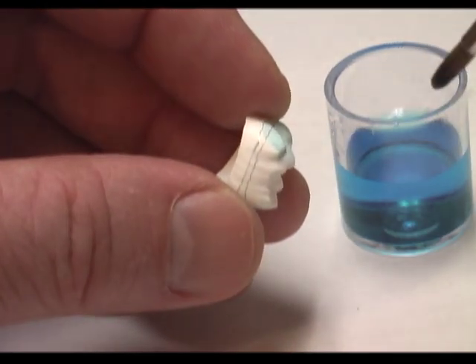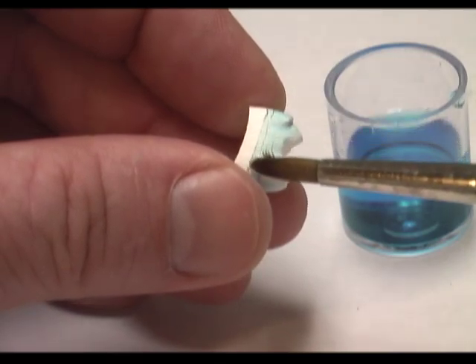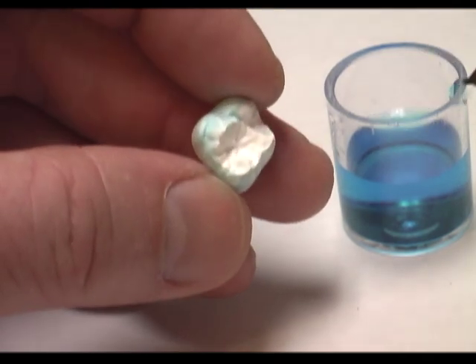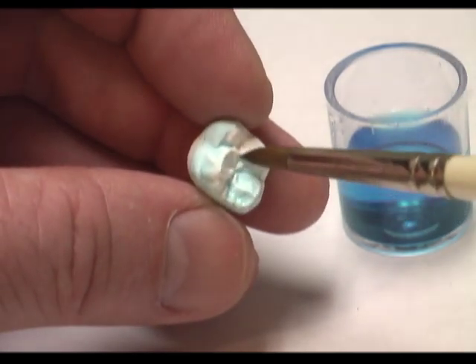So in this first coat we go all the way down to the line closest to the margin, and we finish the entire surface circumferentially, and then also one layer on the occlusal.